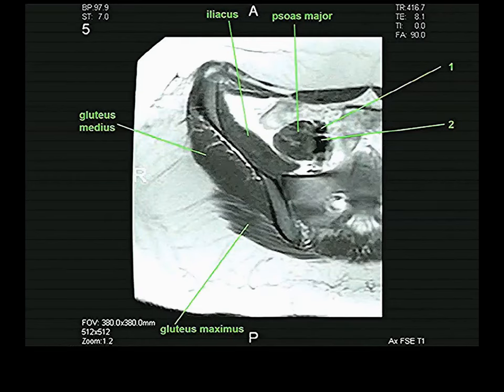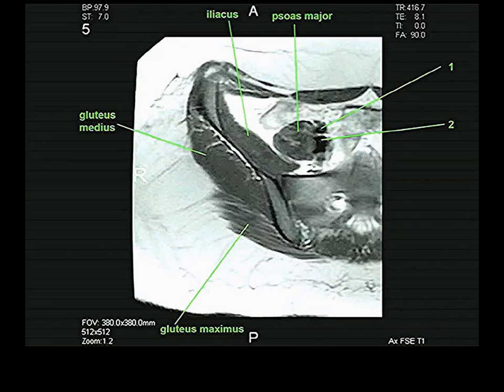The gluteus maximus always has a striated or feathery appearance due to the fat within it, and it arises from the very back of the iliac blade as well as from the sacrum. The iliopsoas is the iliopsoas region, and the psoas major muscle is also identifiable here.